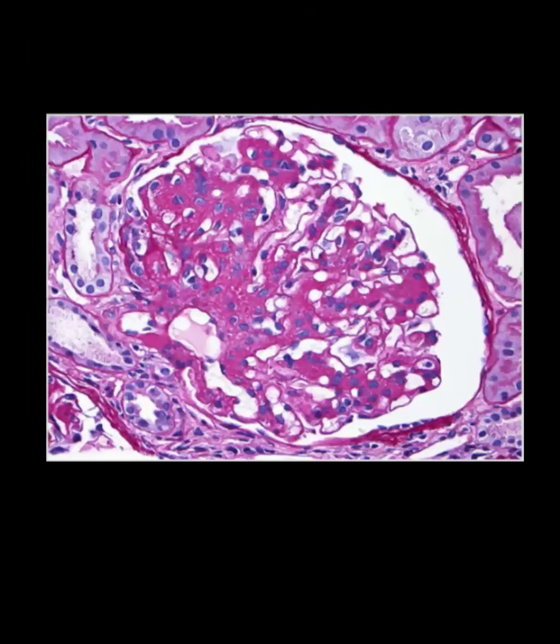Which is this stain? Can anybody tell me the name of this stain? PAS. Yes, it is a PAS, periodic acid Schiff stain. So it is showing the magenta color. So you can again see it.